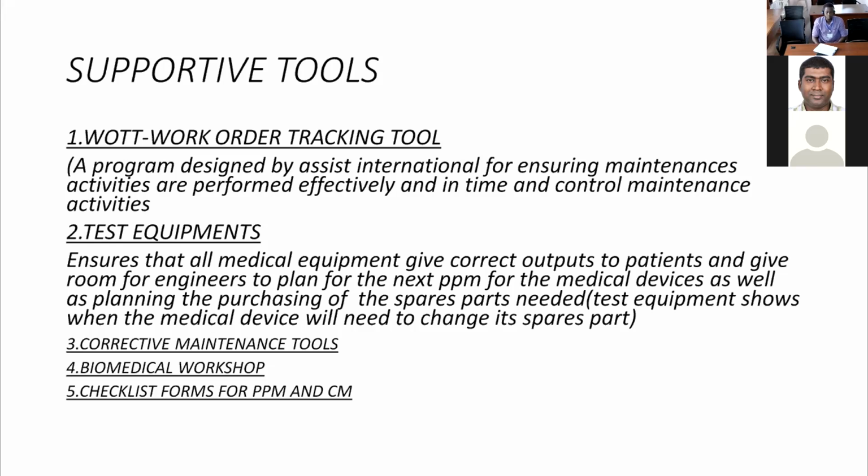Test equipment can show when the medical device will need to change its spare parts. So you can see it has given us very good room to plan for the next PPM, to plan for the time to change spare parts on the machines. That's why you see the number of working medical equipment is so high on the list.